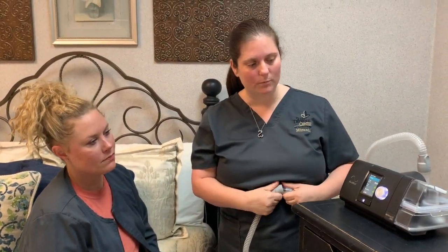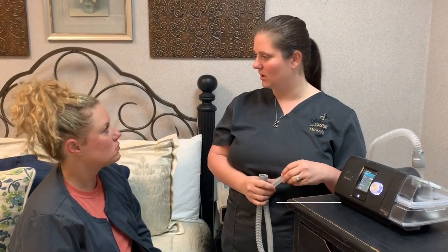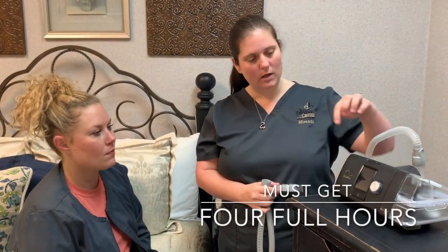Every morning when you wake up, the machine is going to give you a little report. It's going to tell you how many hours you used it — you just want it to be greater than four hours. So if you wake up and it's at three hours and 58 minutes, put it back on for two more minutes to get your full four hours.